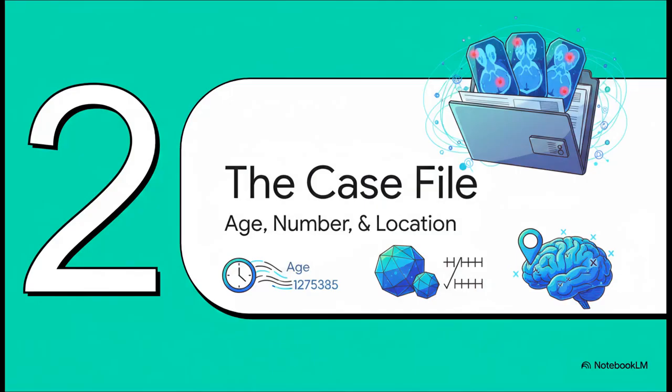Okay, so once we've figured out if we're inside or outside the brain, it's time to open the case file. The patient's age, the number of masses we see, and their exact location, these 3 bits of information are going to shrink our list of suspects down like you wouldn't believe. It's just basic detective work, but man, is it effective.